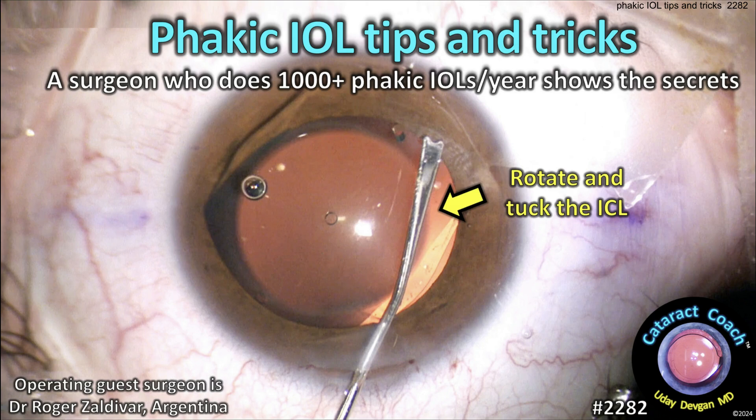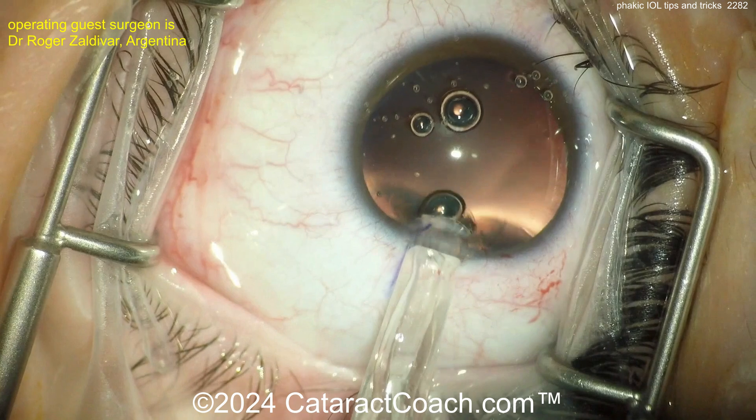cataractcoach.com. Phakic IOL tips and tricks. A surgeon who does a thousand phakic IOLs a year shows us the secrets. Let's watch.